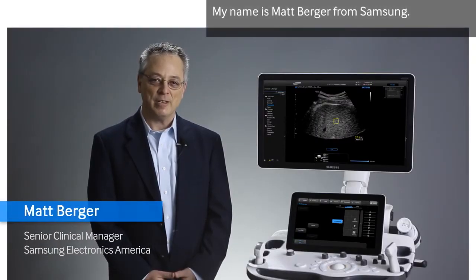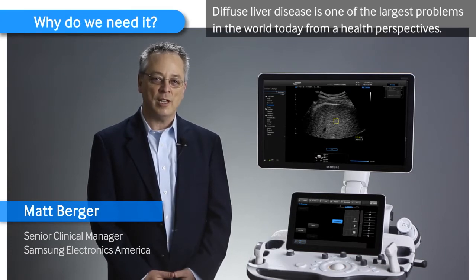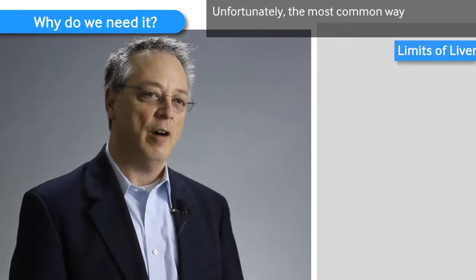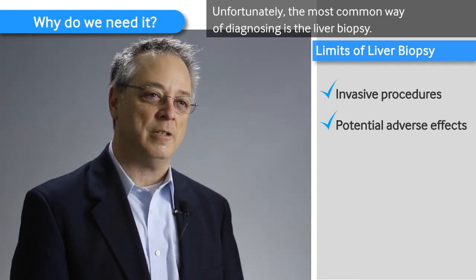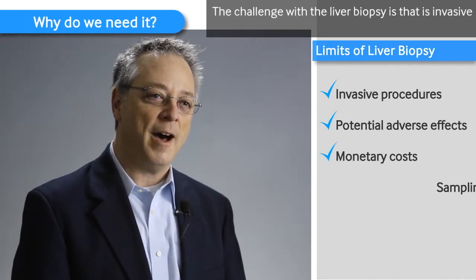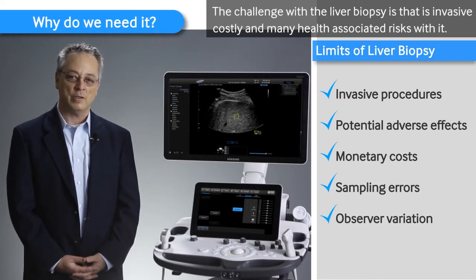My name is Matt Berger from Samsung. Diffuse liver disease is one of the largest problems in the world today from a health perspective. Unfortunately, the most common way of diagnosing is through liver biopsy. The challenge with liver biopsy is that it's invasive, costly, and has many health associated risks with it.